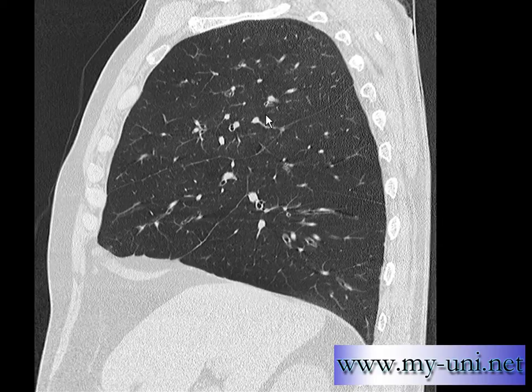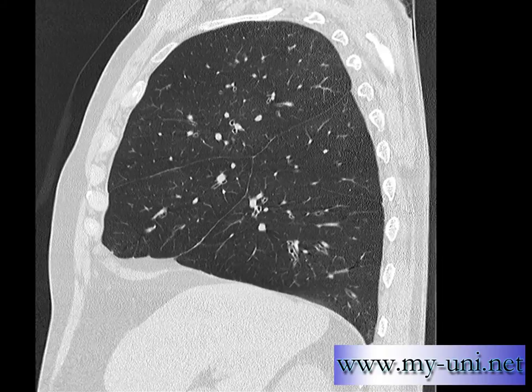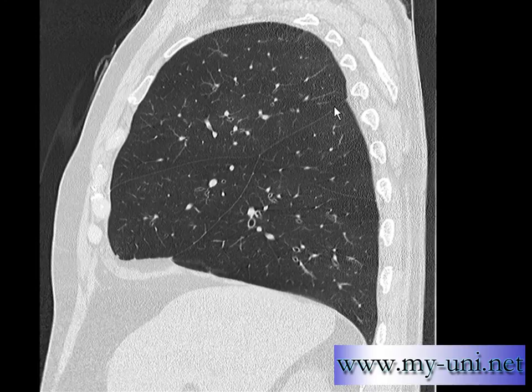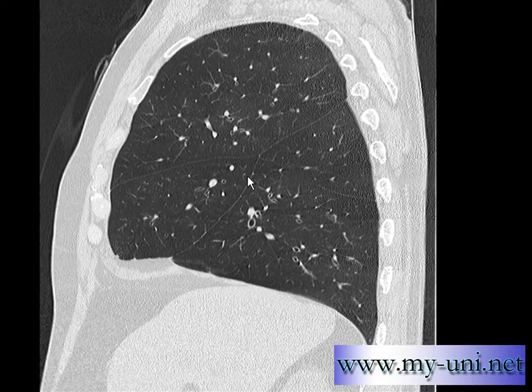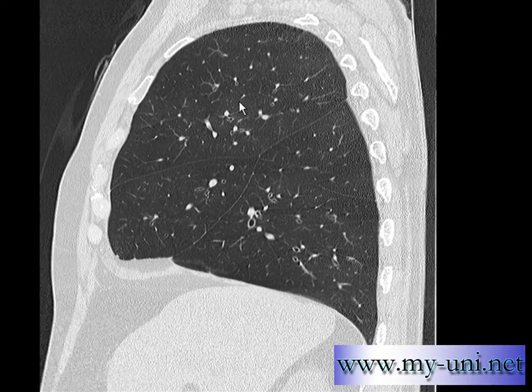I'll move to the next cut, which will be more lateral. As you can see, there are three fine lines. This is the oblique fissure in the right lung, also known as the major fissure. This is the horizontal fissure, or minor fissure. The left lung does not have this one, so there is only an upper lobe and a lower lobe in the case of the left lung.